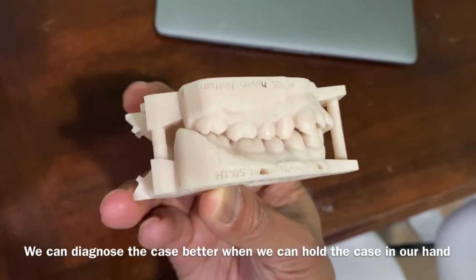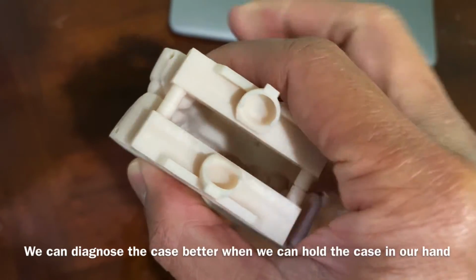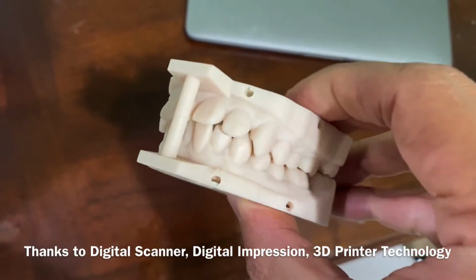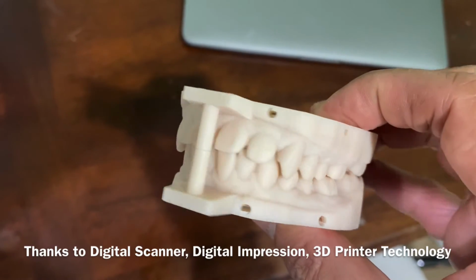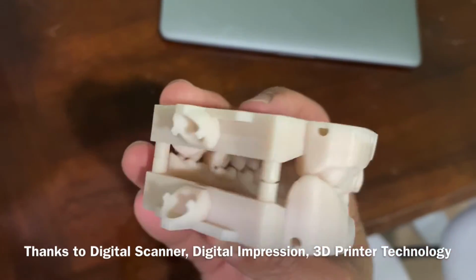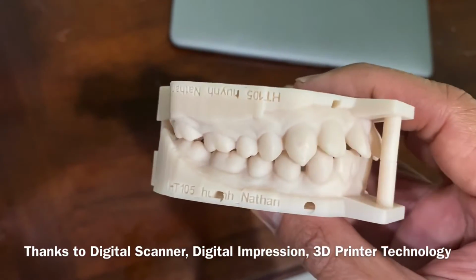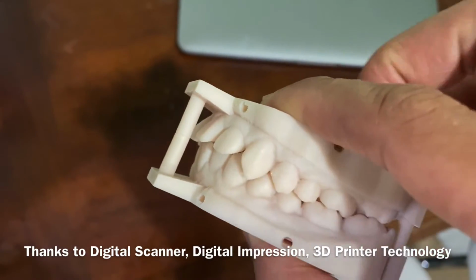What do you see? Well, this is the 3D printing model. I just had it printed out from one of my orthodontic cases. It's beautiful. As you can see, the way they print it gives me an opportunity to evaluate the patient from front to back. In dentistry, we say posterior, anterior, and you can see everything.